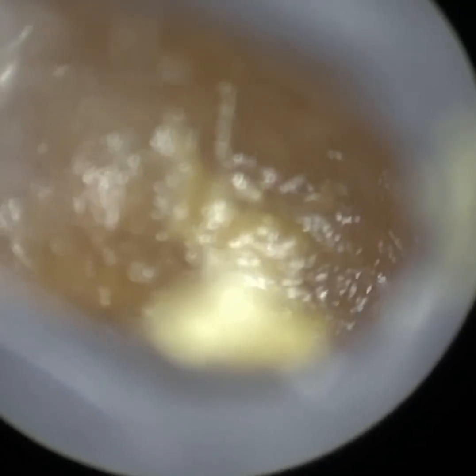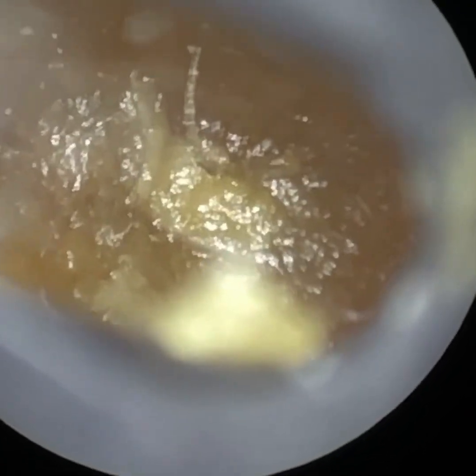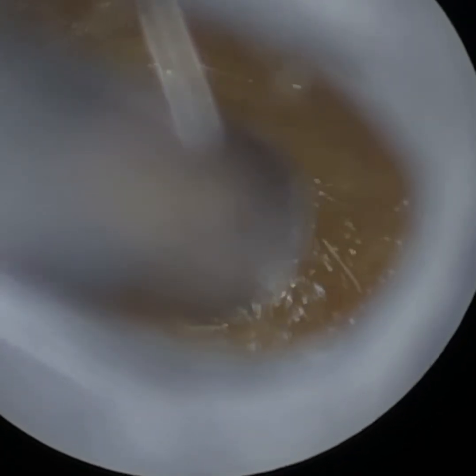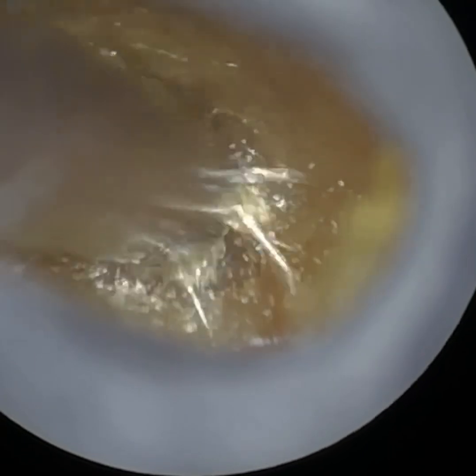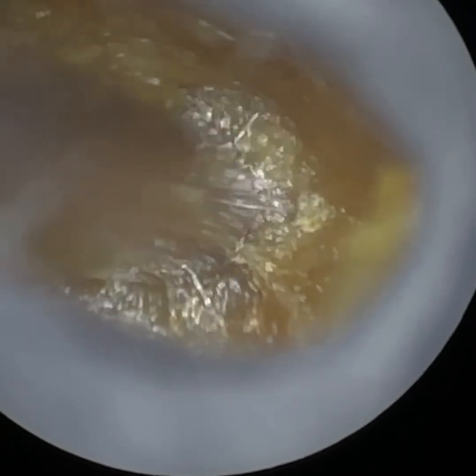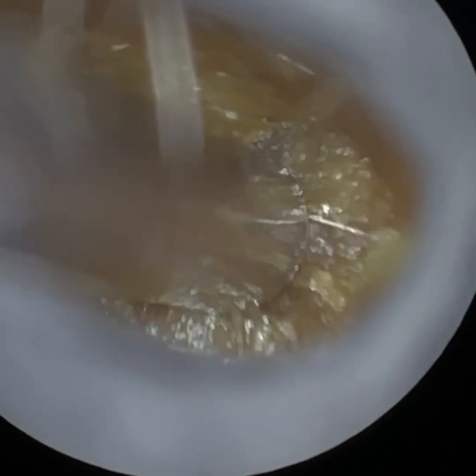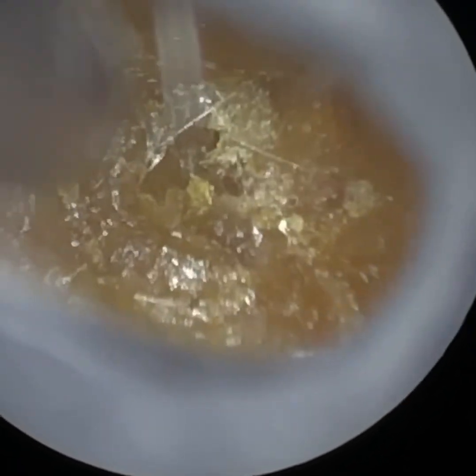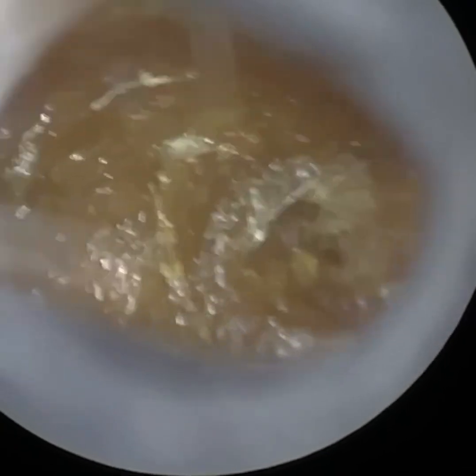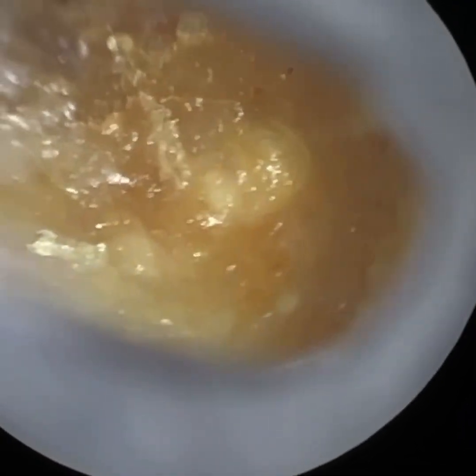Hi everyone, this is Mr. Neil Reiteter, Consultant Audiologist and Director of Clearwax. Welcome to another demonstration video of our recently developed Waxscope, which will be available to purchase from early autumn 2022. If you are interested in learning more about the Waxscope and purchasing it once it's available, please feel free to email us at info@clearwax.co.uk and we shall add you to our mailing list to keep you updated.